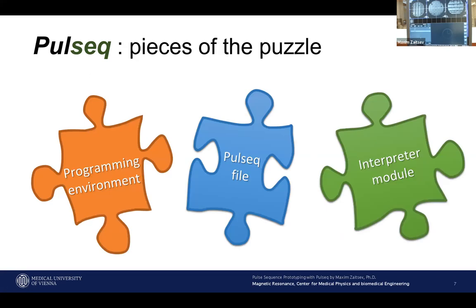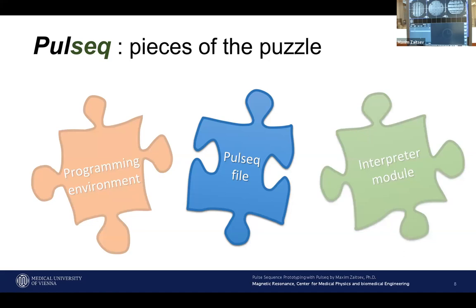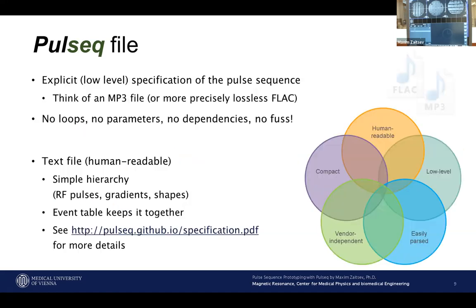To make it possible, we basically created these pieces of the puzzle. We have the programming environment, which fits to the Pulseq file, and we have an interpreter module which can also connect to the Pulseq file. So let's start with the central bit here. The Pulseq file is a really very, very explicit specification of the pulse sequence. If you think of it, it's not sheet music, it's not your notes to play something on the piano where you can still apply some variations. It's really a sound file. It's like a lossless capture of your pulse sequence.